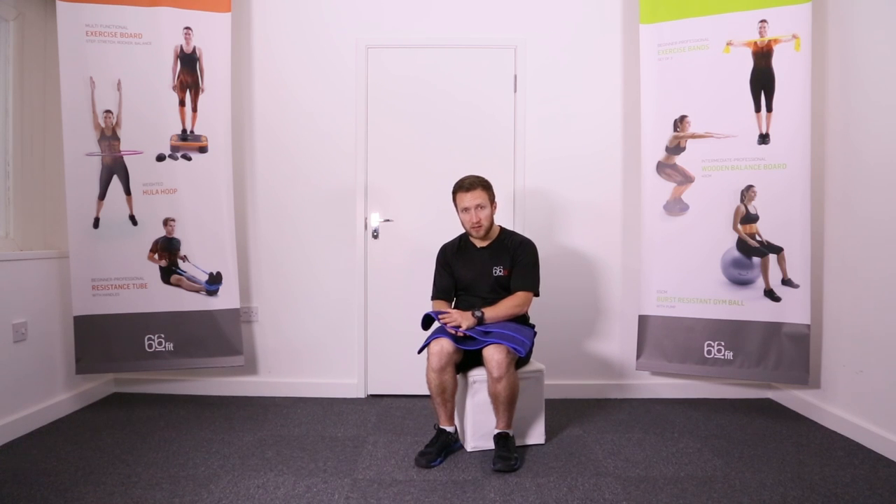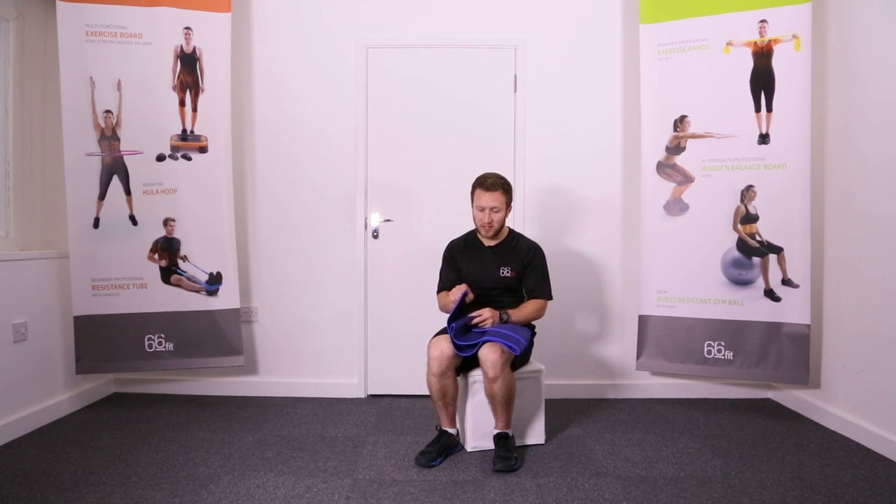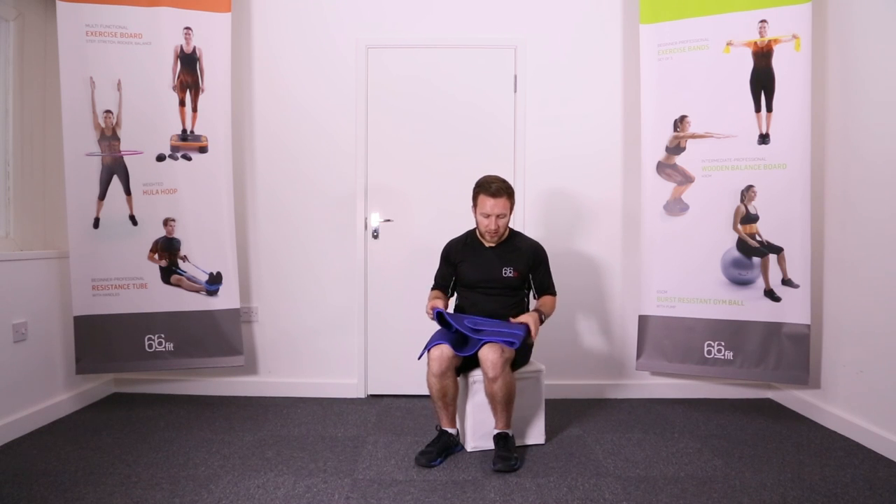It's super easy to keep clean — you can put it in the washing machine up to a maximum of 40 degrees. If you are going to do that, we recommend folding it up and fastening it in place so it doesn't flap about whilst it's in the washer.